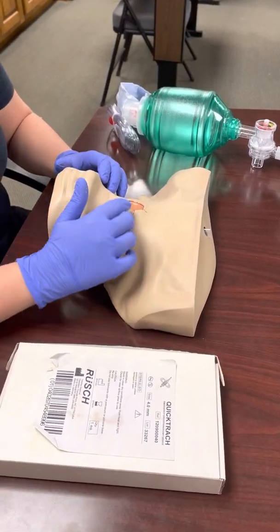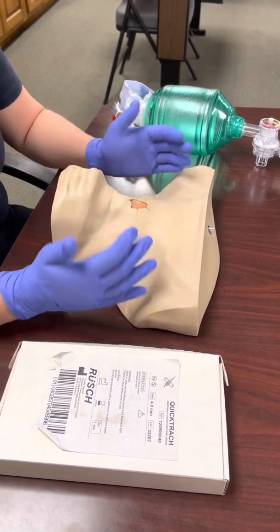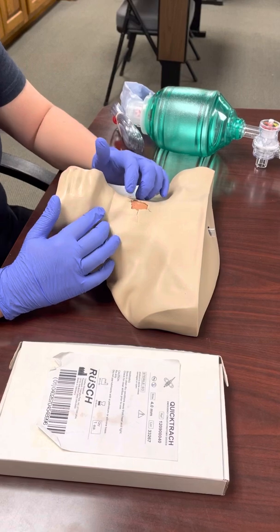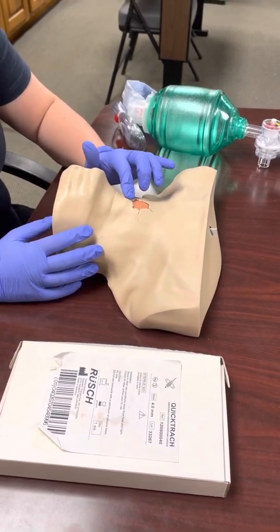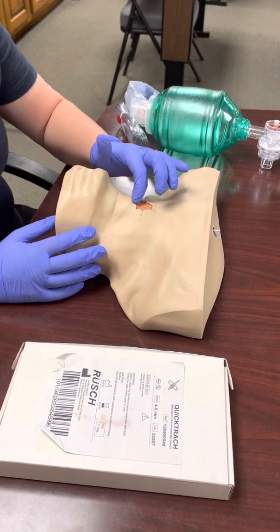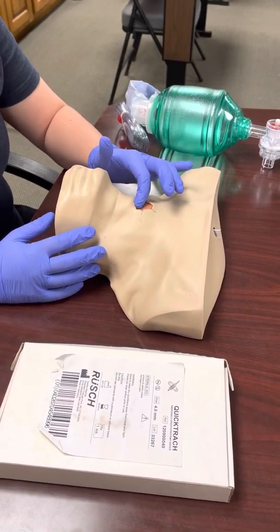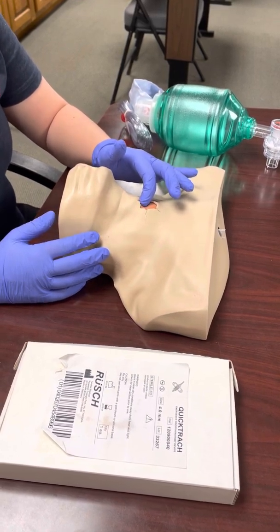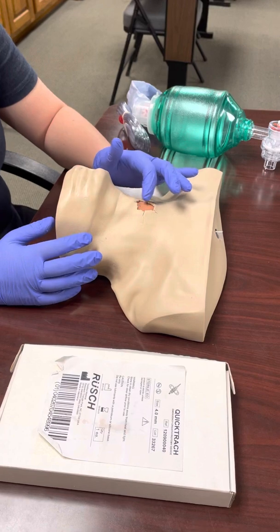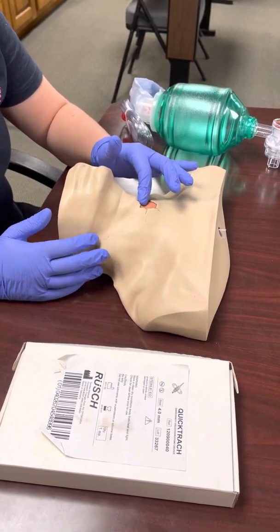The first thing we want to do is find our landmark — the cricothyroid membrane. On this mannequin it's going to be where the open area is, but we can find this on any patient. You're going to be at their head. Find their Adam's apple, which is their thyroid cartilage, feel a little divot, then find their cricoid cartilage. That membrane in between — that little divot — is what we're aiming for to introduce our Quick Trach.